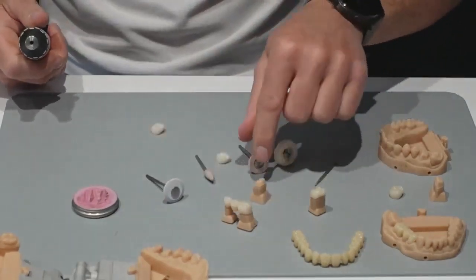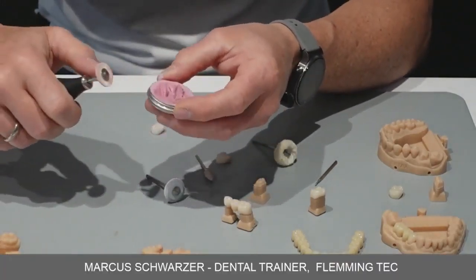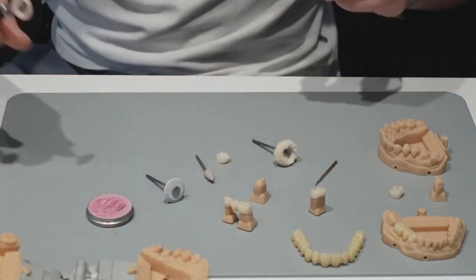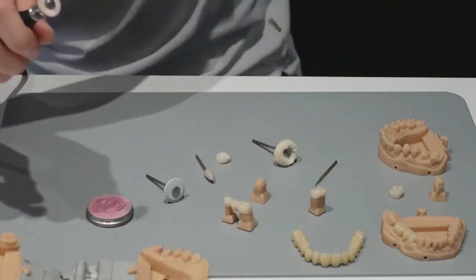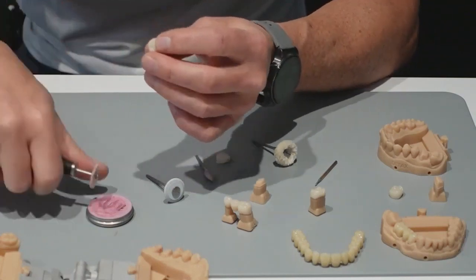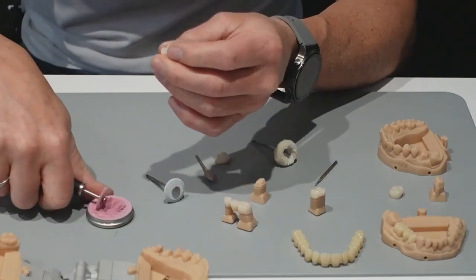After that, we take a diamond polishing paste. We need diamond polishing paste because this material is very strong, stronger than the gem material. Yeah, so there are some filling materials inside, and we discussed it before the webinar. So you said it is the best way, the easiest way to do it. The classic way to polish it is not so easy with this material, right? Right.